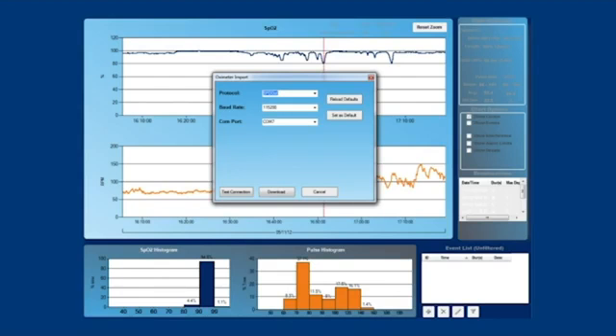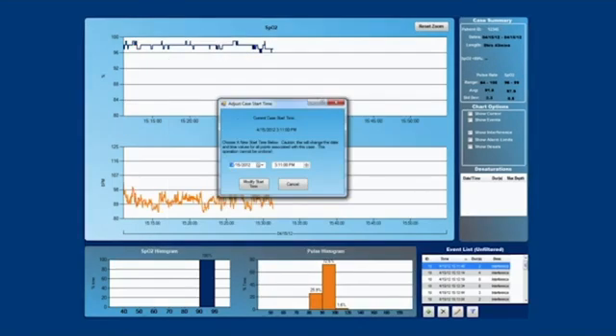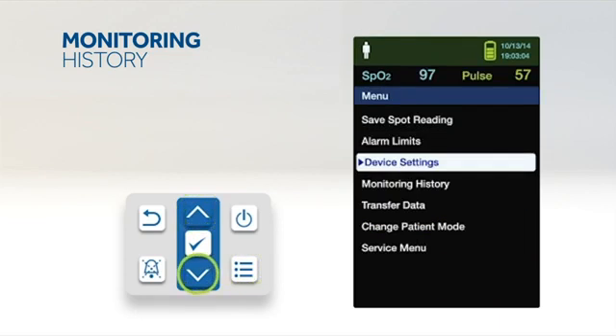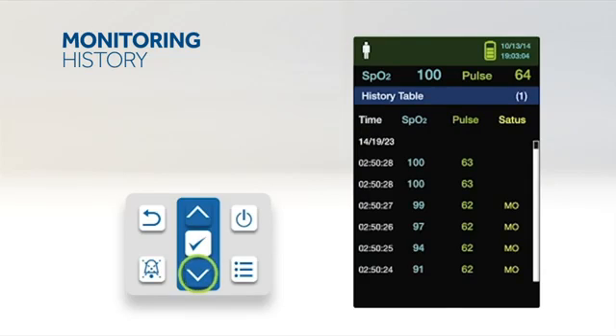The monitoring system supports wired data export to an external personal computer for data analysis and printing, with up to 80 hours of data storage capability. The PM10N presents trend information in tabular format, with the newest data values appearing at the top. To review monitoring history, press the menu button, press up or down to highlight monitoring history, and press OK. From the monitoring history menu, select view spot data or view continuous data. Use the down arrow to scroll, and adjust the display interval by pressing OK to show every 1, 5, 100, or 500 data points.